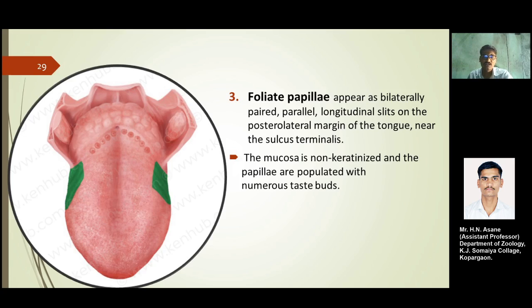This mucosa is a non-keratinized mucosal layer, and the papillae are populated with numerous taste buds. These parallel longitudinal slits are the foliate papillae.